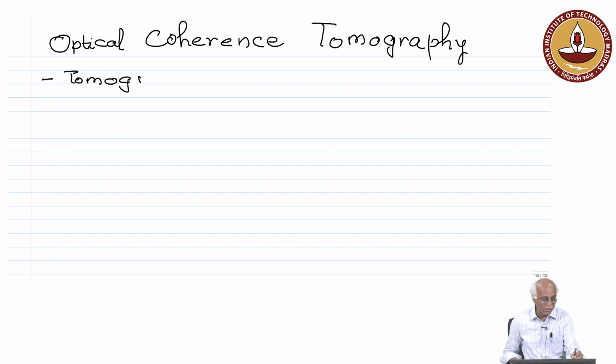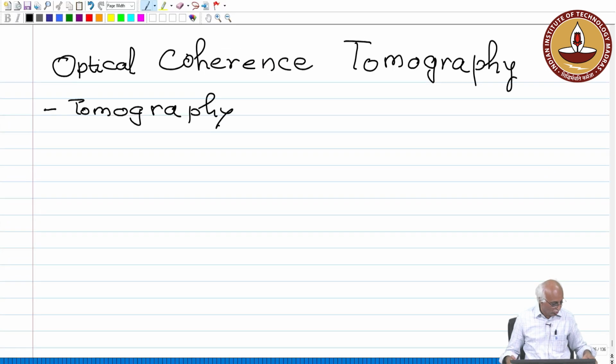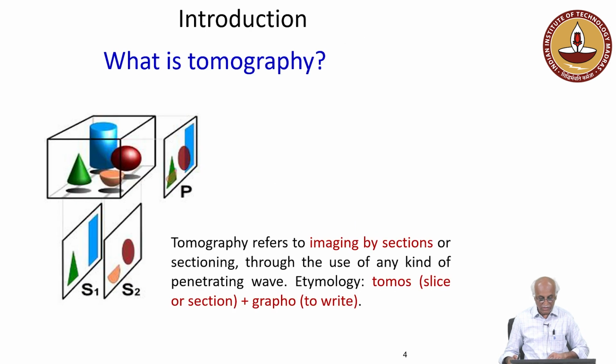Some of you must certainly know about it. We must have also heard about CT scan, computed tomography, etc. So basically, what does tomography mean? It is as simple as imaging, whatever it may be, a specimen or a sample, layer by layer. Imaging layer by layer is tomography.